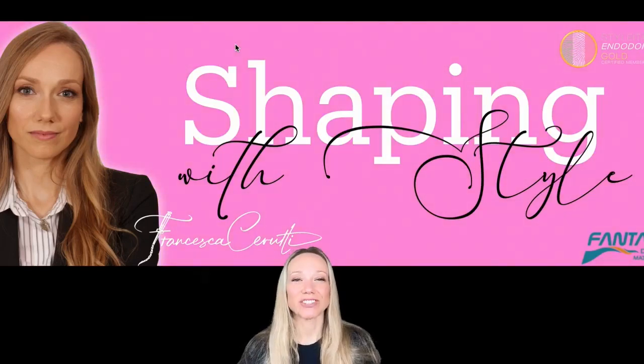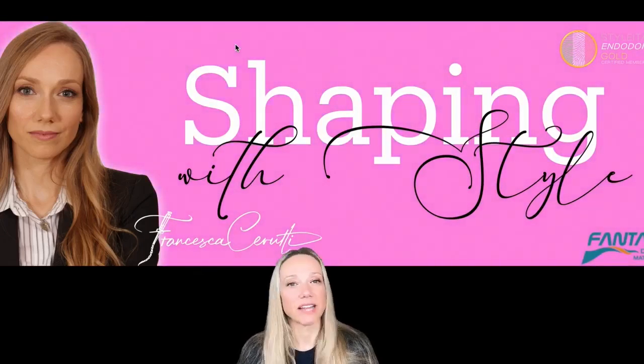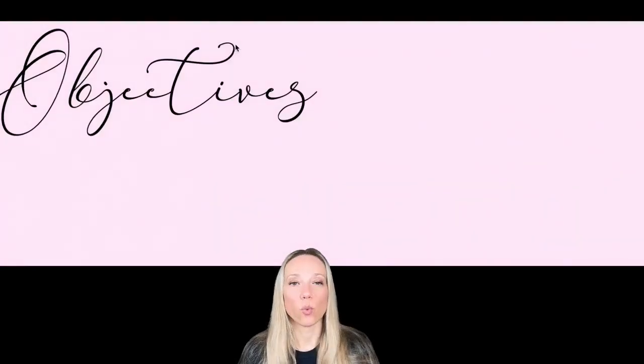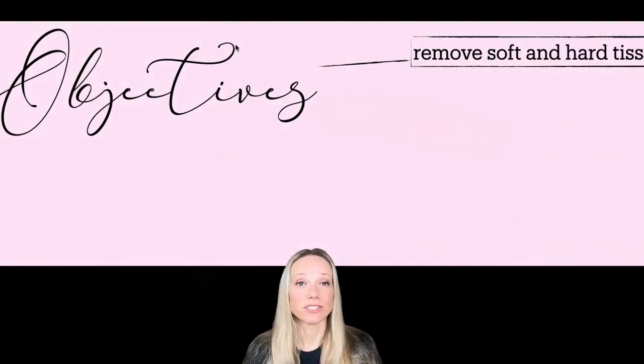So the title of this lecture is Shaping with Style. And we are going to talk about some files that I quite enjoy. But first of all, when we shape, we have to have clear in our mind which are the objectives of our shaping. And so we have to remember that the first thing that we want to obtain when we shape the root canal system is to remove the soft and hard tissue that could give room to the bacteria. And so this is the first thing that we want our files to take care of for us.